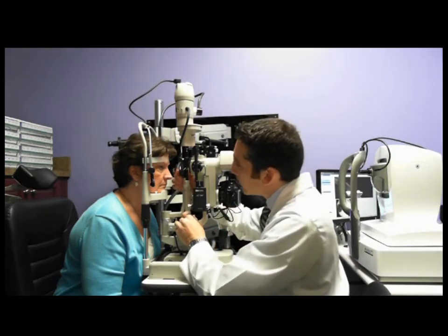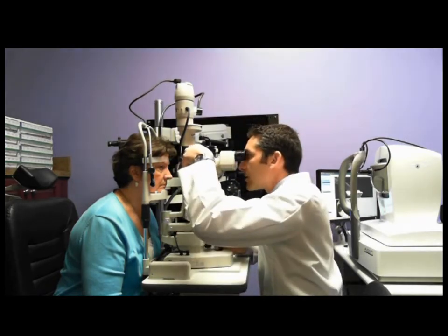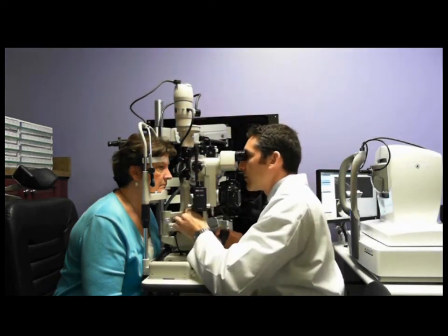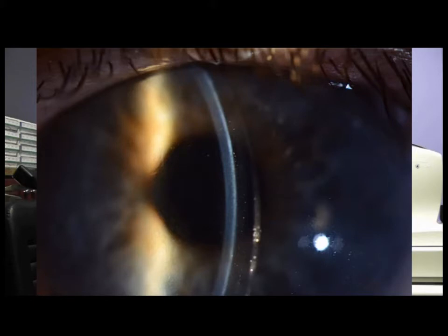So the first thing we're going to do is we're going to increase our magnification. We're going to bring our slit beam to 45 degrees. We're going to trim it down to an optic section, and we're going to judge the vault. Now, on this eye, you can see that there's quite a bit more vault than the right eye. Now remember, this is the steeper base curve.